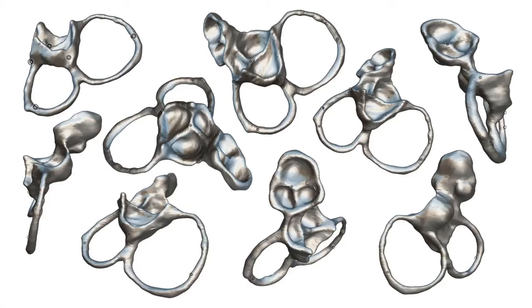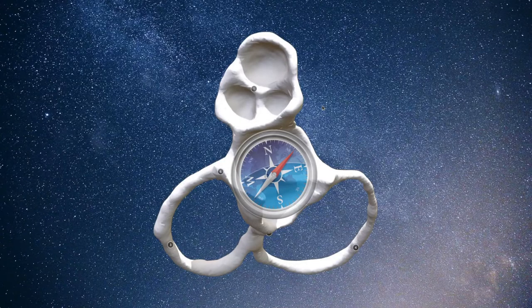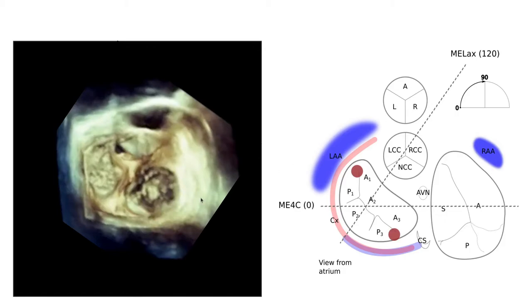One of the great powers of 3D echo is that it gives us the ability to spin the images around regardless of where we acquired them from. Our goal now is to visualize the heart base embedded in any 3D dataset that has enough surrounding context — basically using the heart base as a compass to orient us. Here again is a full volume dataset of the heart base: you can see the aortic valve in the middle, just like our schematic, tricuspid valve on the right, mitral valve on the left, and the distant pulmonic valve.